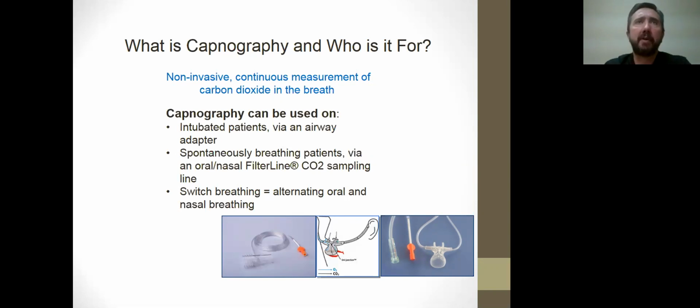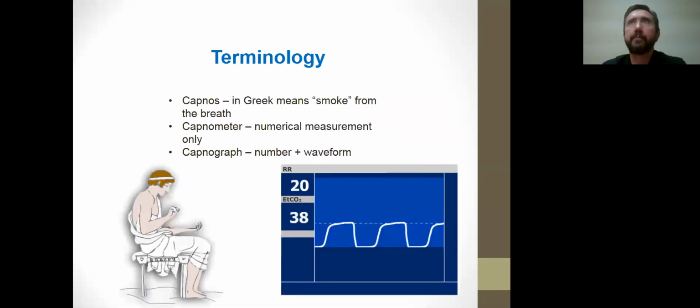Also, with capnography, we want to use it to its full potential with every patient with an altered level of mental status and deficiency in the ABCs in assessment. So, let me give a few definitions and terminology here. Capnos means from the fire of life. It's the metabolism. Remember that metabolism produces carbon dioxide as a waste product.